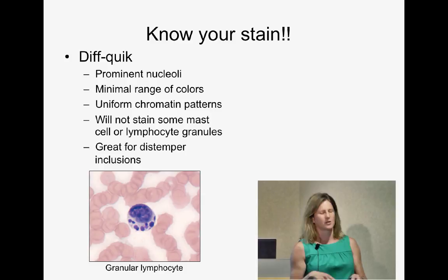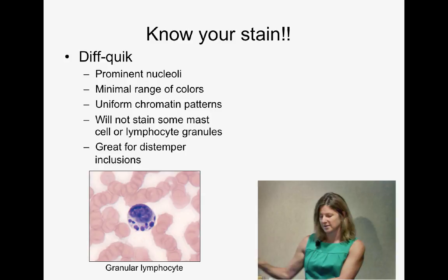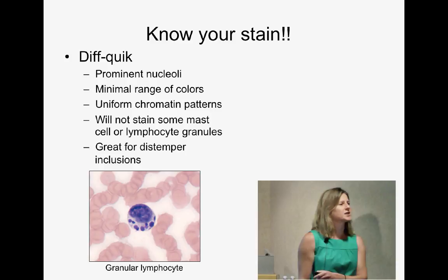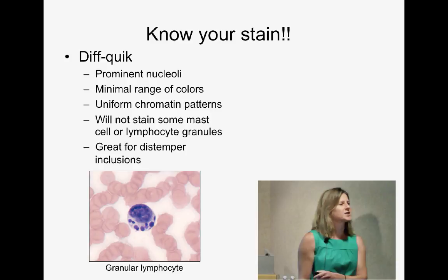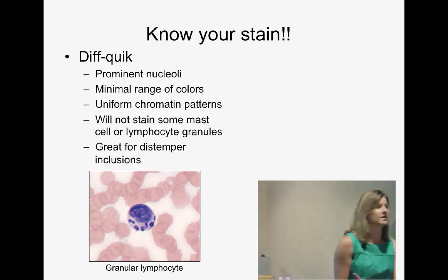Diff-Quik will not stain mast cell granules or lymphocyte granules. This granular lymphocyte in a cat — if seen in blood — indicates lymphoma, a particularly nasty type. Unfortunately those granules don't stain with Diff-Quik, so you can miss this diagnosis. However, Diff-Quik is actually excellent for distemper inclusions: with Wright's stain, inclusions are pale and hard to identify, but with Diff-Quik you can clearly see lovely pink inclusions in red cells and neutrophils. So if we suspect distemper, we use Diff-Quik specifically.